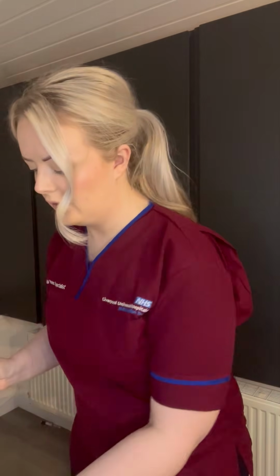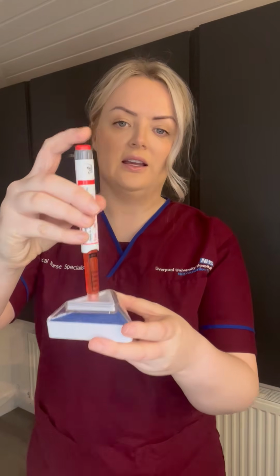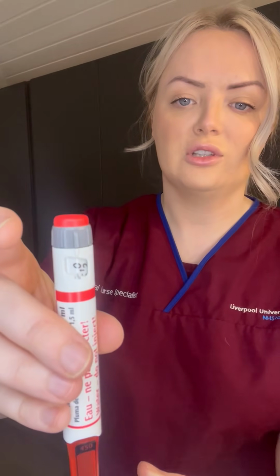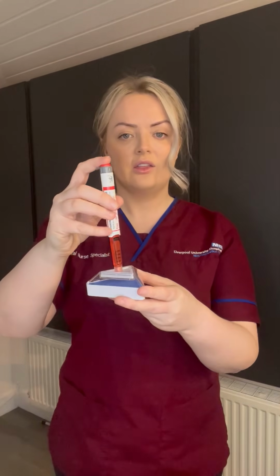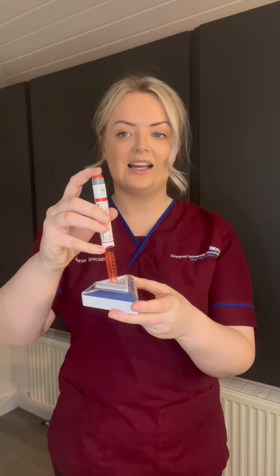So the same technique where they would dial up a couple of units, do an air shot, you can see that the liquid has come out there, so then they would dial up to their correct dose. So they're going to be on 10 units as well. And what they would do is inject again, the exact same injection technique, 90-degree angle onto clean skin in the correct site. And you just go directly in and press it down until it goes back down to 0 as shown. Then count to 10.